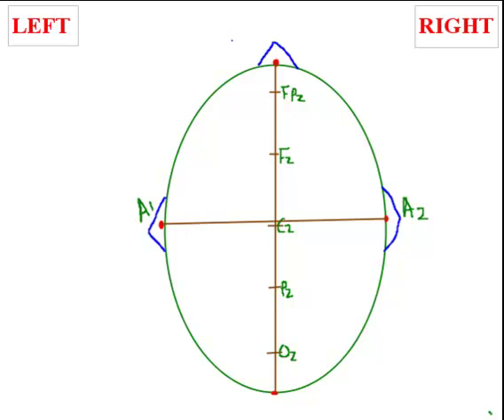Then, you measure the distance between the two preauricular points, calculate 10% of this distance, and put a mark here, at 10%. So, this area is 10%, approximately 10% of the two preauricular points.